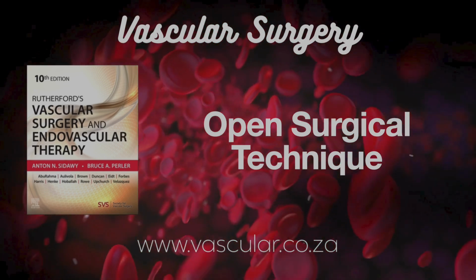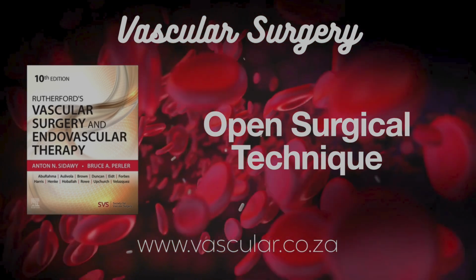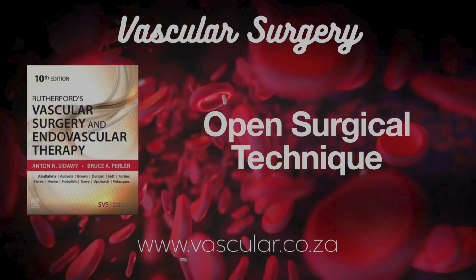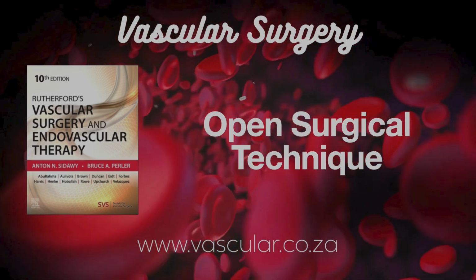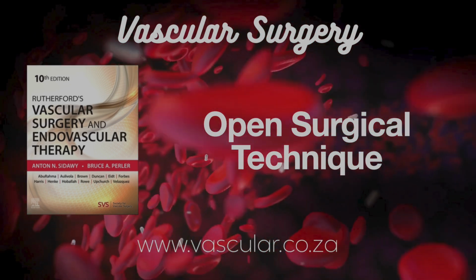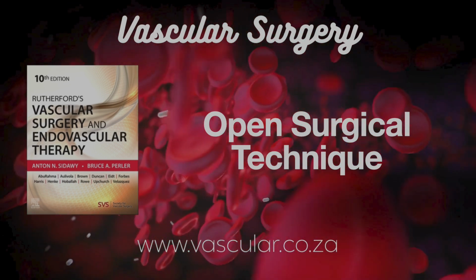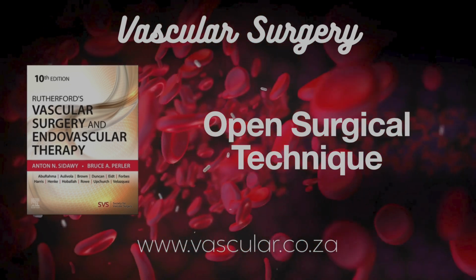Let's start with open endarterectomy, the standard approach. Often, yes. Make a longitudinal incision over the plaque. Carefully separate the plaque from the artery wall. Finding the right layer seems key. Absolutely crucial. You hold the adventitia edge, develop the plane between plaque and outer media, adventitia. A Freer elevator helps push the outer layers away from the plaque. Work all the way around. Yes, circumferentially. Minimal resistance in the correct plane.